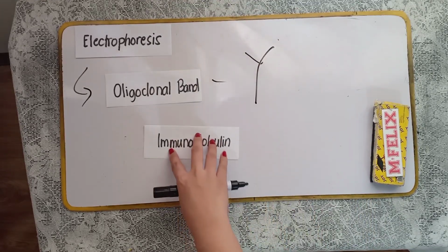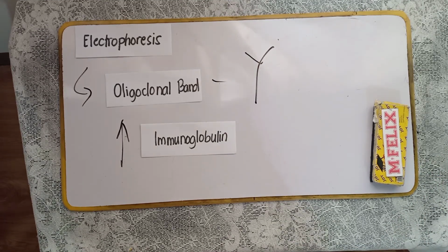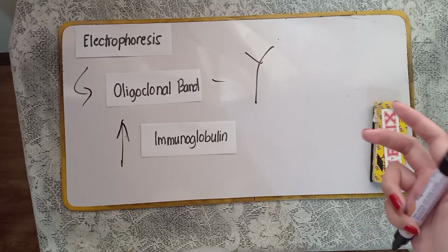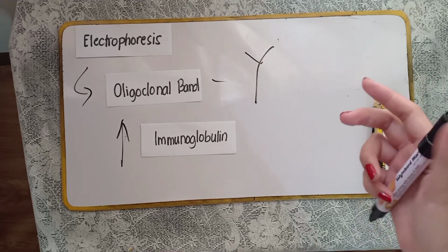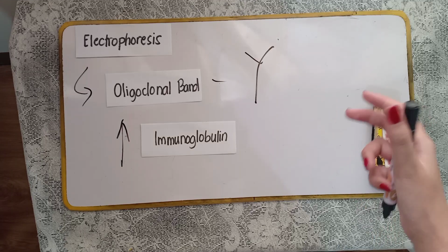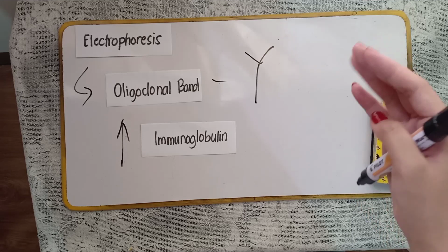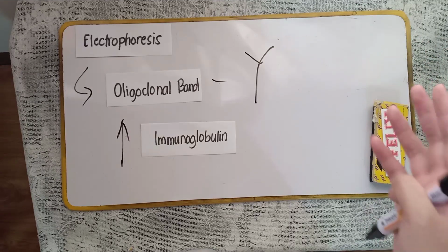now an increased production of immunoglobulins. Now, when it comes to performing protein electrophoresis, class, I want you to remember to ensure that these oligoclonal bands are really a representative of a neurologic inflammation, or let's say neurologic disorders, okay, simultaneous serum electrophoresis must be performed also. Meaning, hindi ka lang magra-run ng CSF sample mo, but you always perform it together with the serum sample.